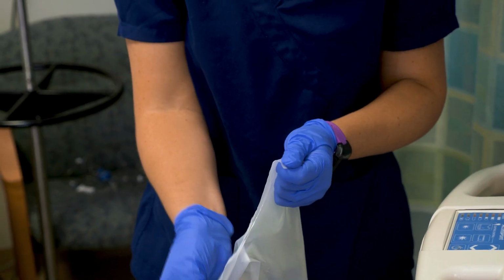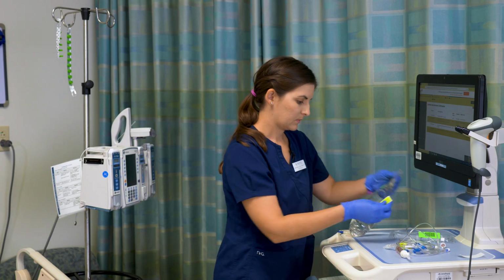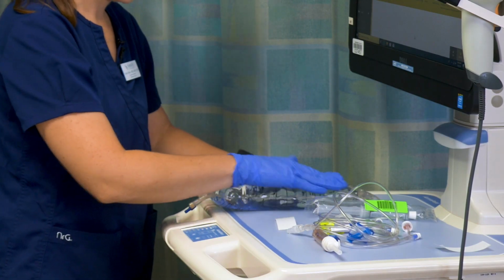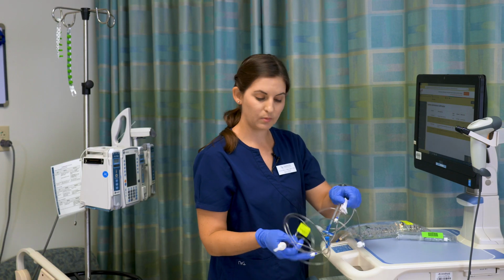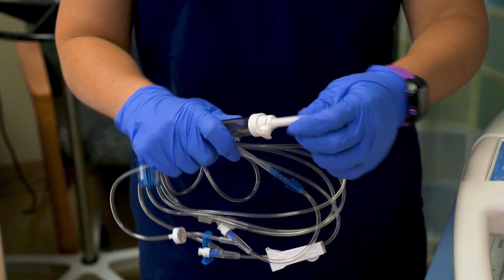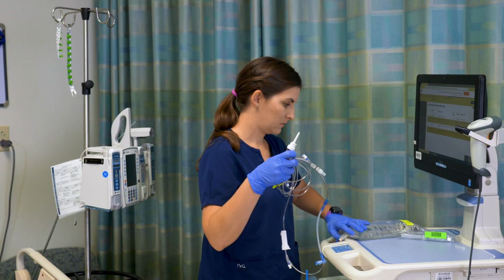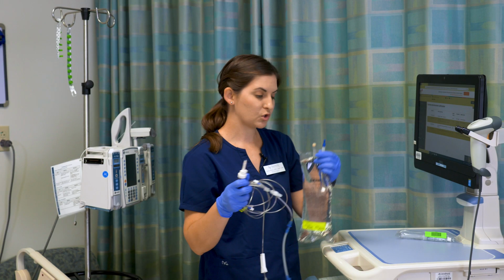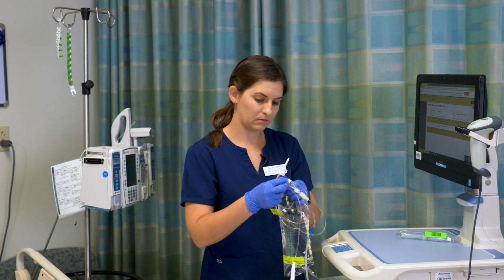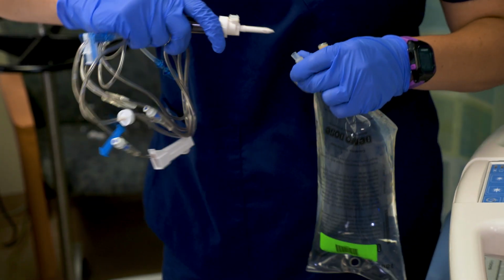I'll now open up my fluid bag, attach my patient's label. I'm going to confirm again that my tubing is clamped before spiking my bag. It's very important that you maintain sterility of the spike. Hold your bag upside down, especially a large bag. It's a lot easier to spike when it's upside down. And I'm going to spike my bag.